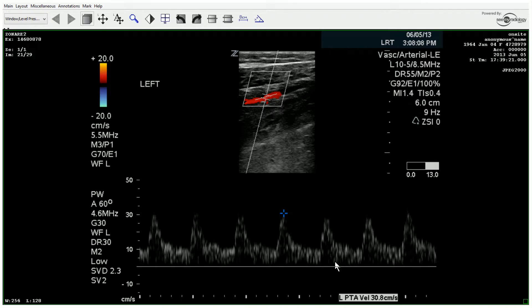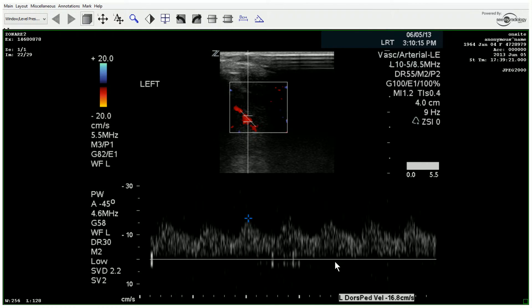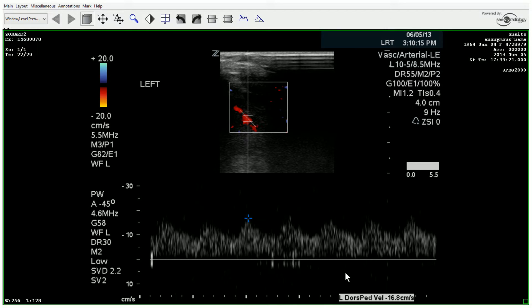We look at the popliteal, peroneal, and posterior tibial arteries. As we get to the ankle — or the top of the foot — we can see that there's a lot of spectral broadening, and almost a Tardus-Parvus waveform here. Distally, the limb is begging for increased flow.